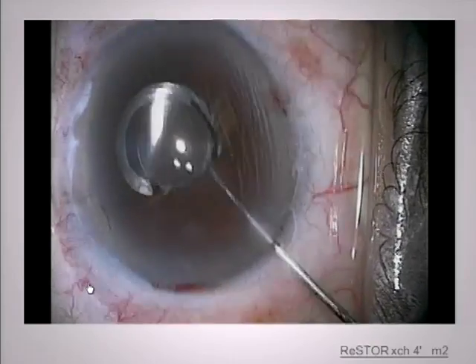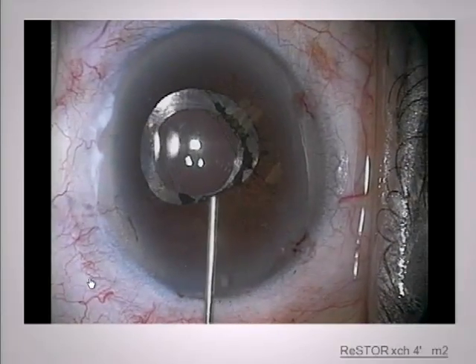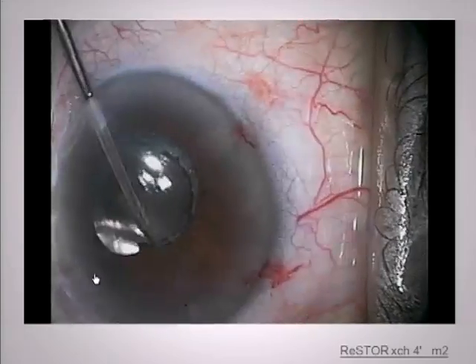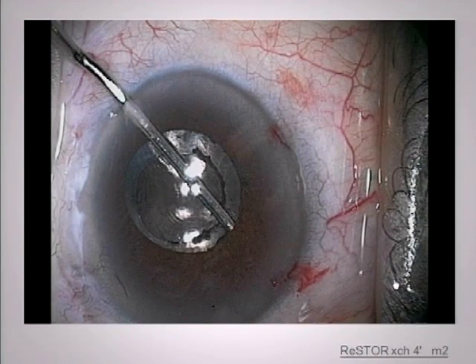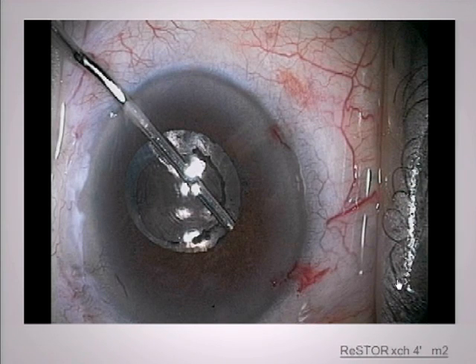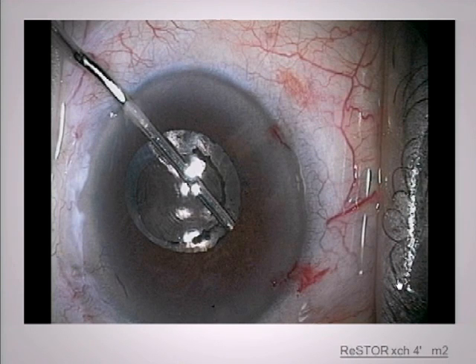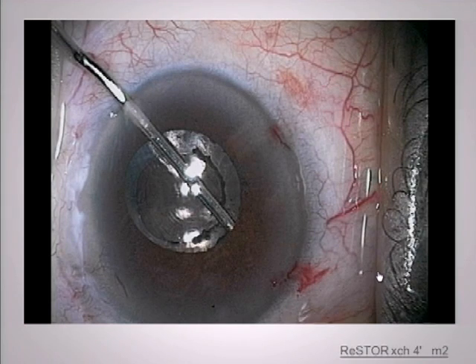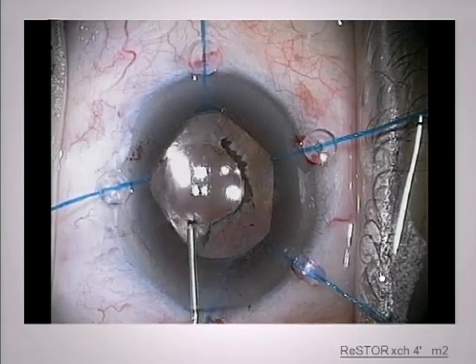The first thing I have to do is break the synechiae here. The question is can we avoid vitreous loss, and how are we going to get the lens out of this small rexis? I think one hard thing is just getting between the lens and the capsule. If you use a needle, like a 26-gauge needle, and turn it so that the bevel is down, you can get between there and start. On that needle, have attached some viscoelastic.